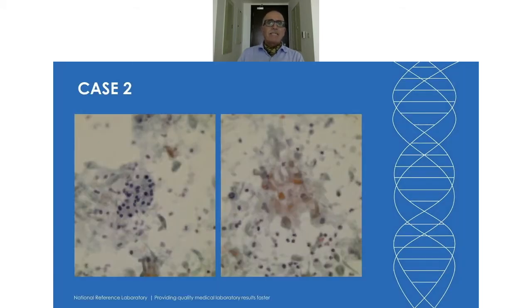And you can see that the background is dirty. It was a cystic type of findings. There were some pretty normal bland cells which had an acinar appearance over here, or at least let's say they were arranged in sheets, but the background was pretty dirty.